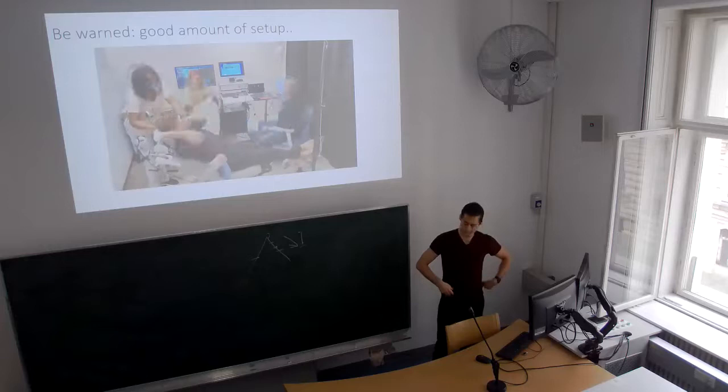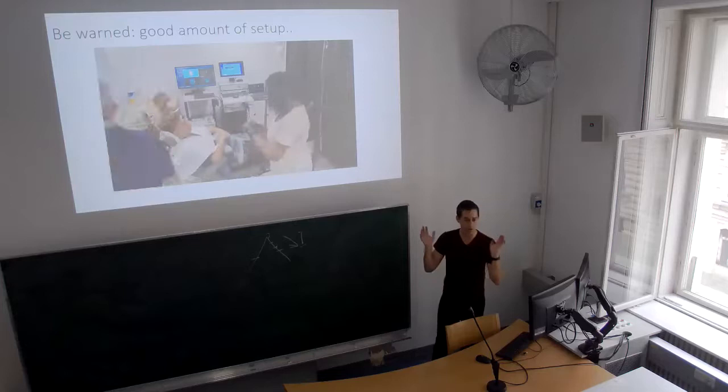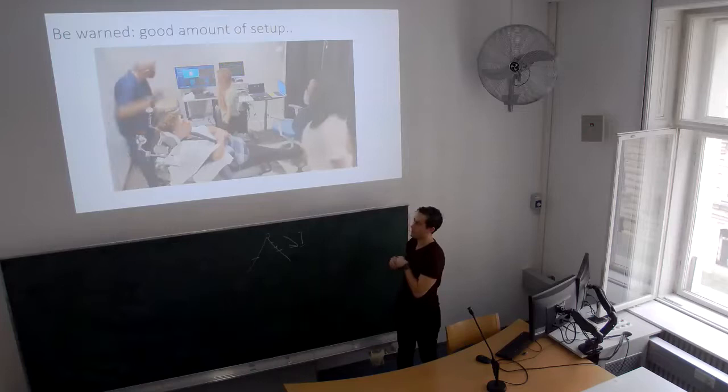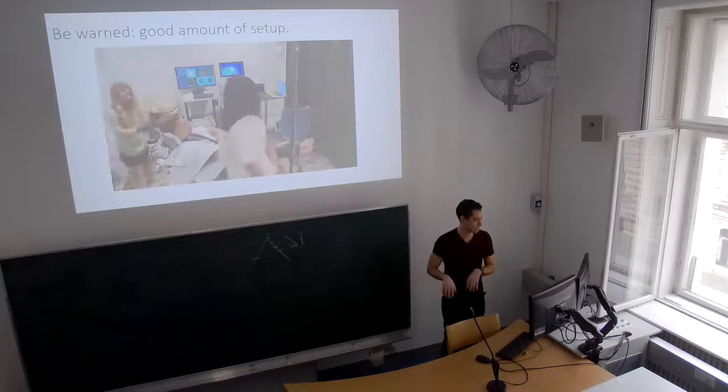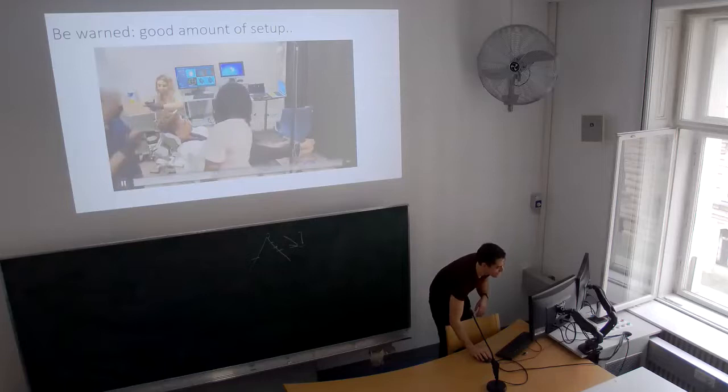As I've said, we can't go through air, so we have to do all these things. We've got to get the hair out of the way as much as we can. Hair can trap air bubbles. We have to have gel. It has to be targeted to millimeter precision. So it can be quite a lot of setup. This is just a time lapse of a study I'm starting soon with my RAs running this. As you can see, it can be quite a lot.